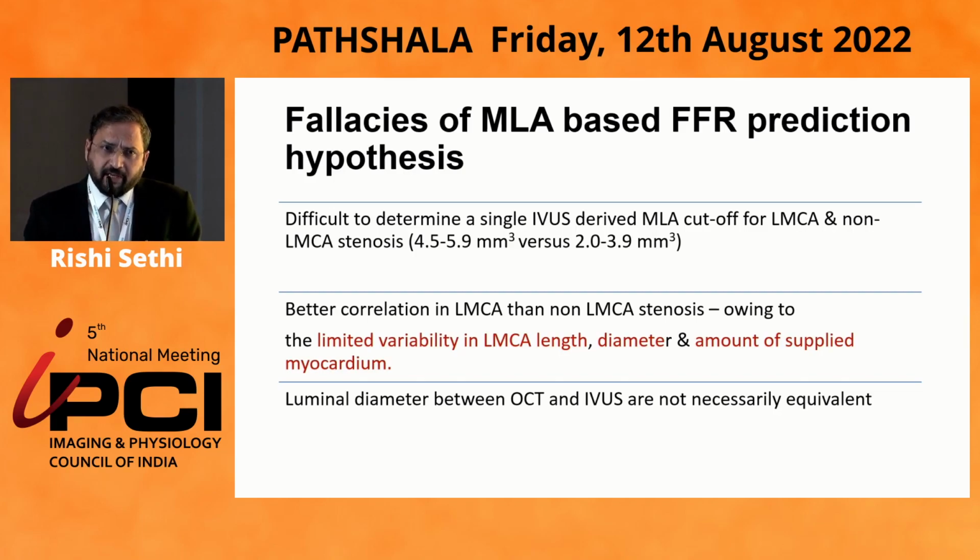But this comes in very handy when we are dealing with complicated diseases of the left main bifurcation and ostial LAD, because in the presence of complex left main bifurcation disease, it is very difficult, even impossible, to assess the physiological significance of an ostial or shaft disease from FFR. Here these MLA values come in handy, and they tell us whether to include or exclude the left main shaft and ostium from our decision making, based upon the clinical studies.